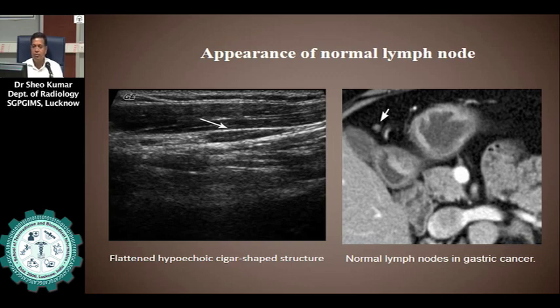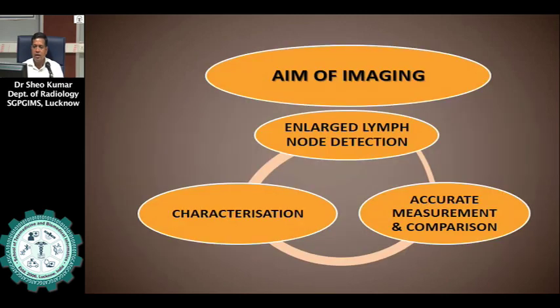Regarding the normal appearance of lymph nodes: on the ultrasound image on the right side, the arrow shows a flattened hypoechoic cigar-shaped structure, which is a normal lymph node. On the left side, the CT scan image shows the arrow indicating small soft tissue attenuating lymph nodes.